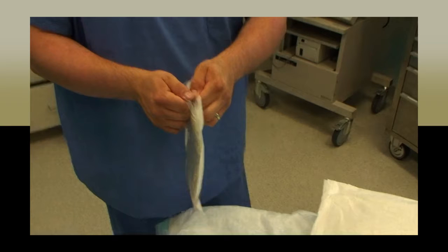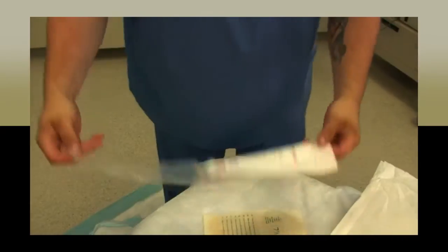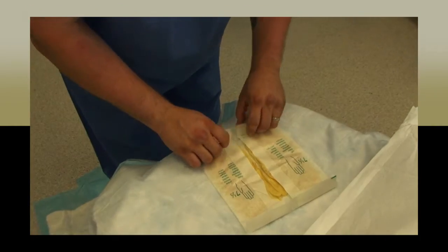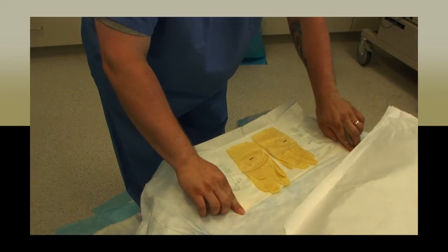To glove yourself with sterile gloves, you'll open a package of sterile surgical gloves that are your size. Take off the plastic cover and unfold the glove paper. You will then open the gloves, following the instructions of the tabs of the paper cover. Once the paper is completely open, showing the 2 gloves, you will begin by grabbing the glove of choice with the opposite hand to be gloved.